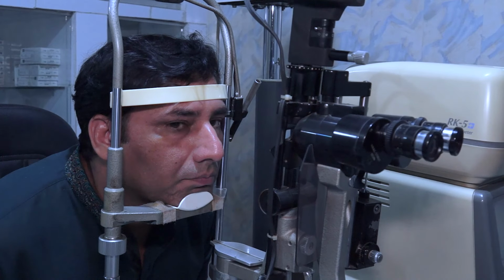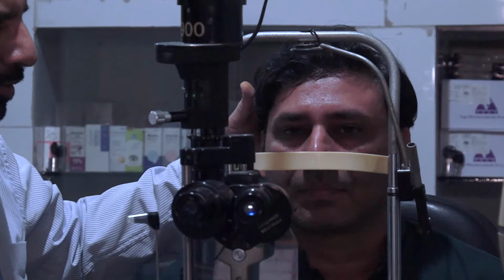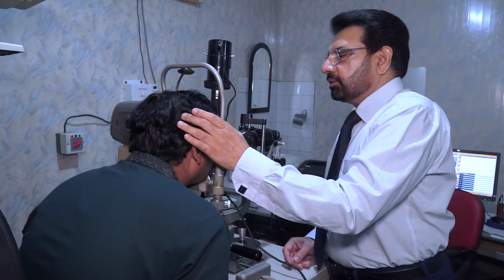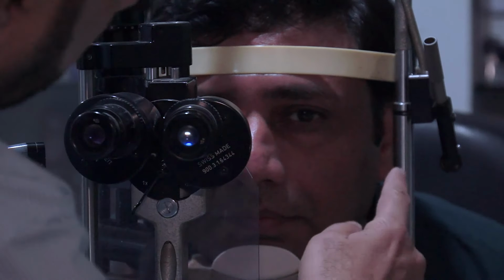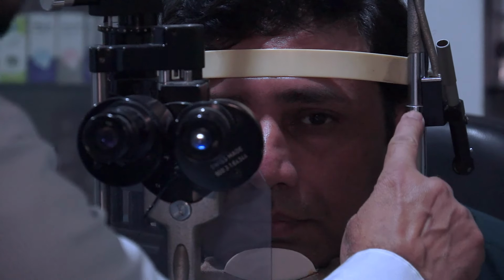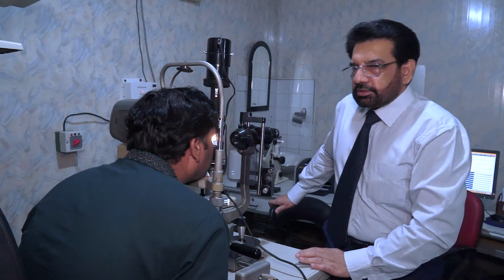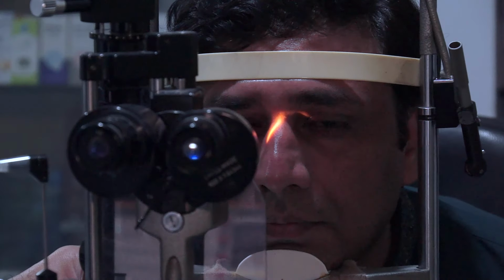Sitting of the patient is very important, and we ask the patient to sit so that the chin is lying in the chin rest and the forehead is lying against this rubber band, and the outer canthus of the eye should be at the level of a black mark on the left side of this chin rest. While the patient is seated properly on the slit lamp, now we are going to examine with the slit lamp.